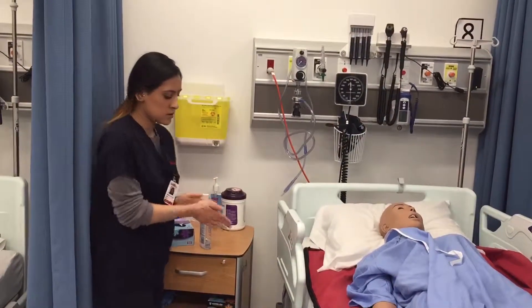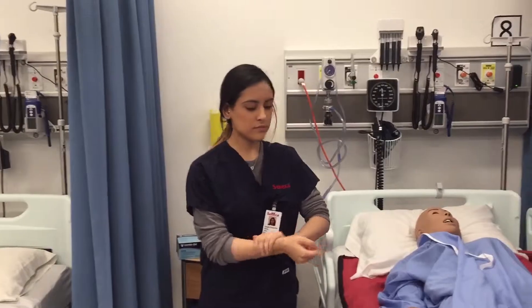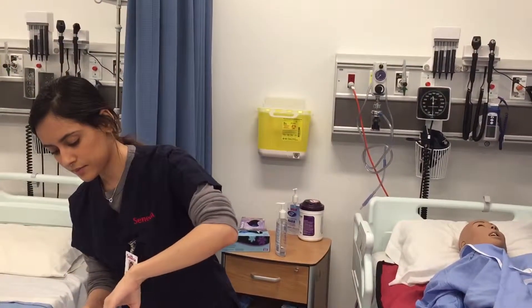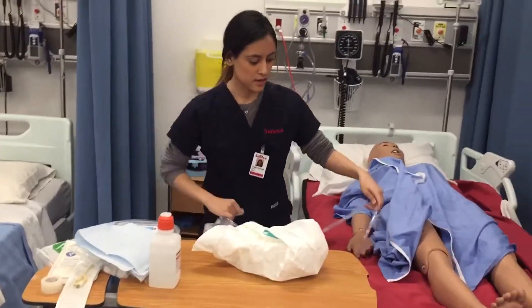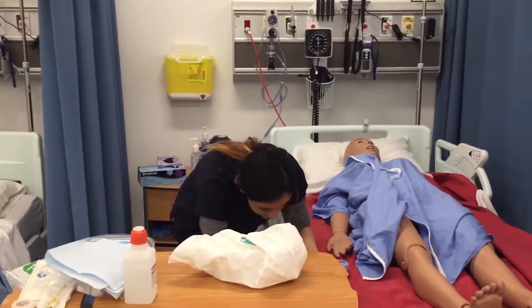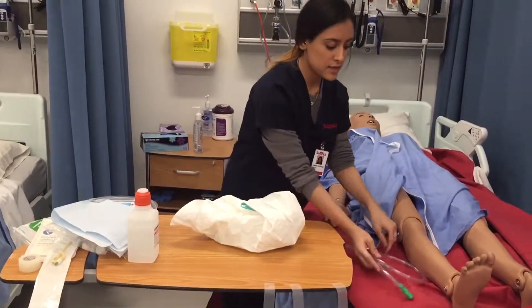I'm going to perform hand hygiene. Then I'm going to get the urinary bag ready. This just goes on the side of the bed, and then I'll leave the cords for when I need them.